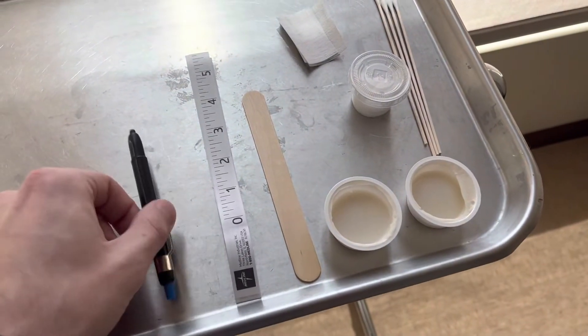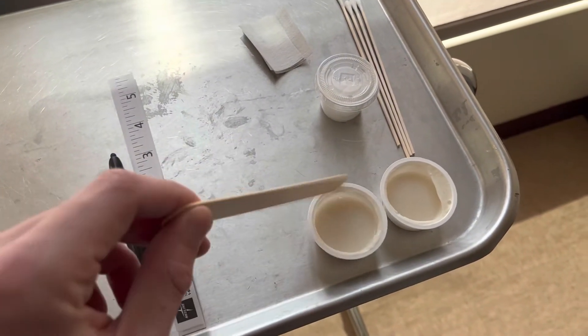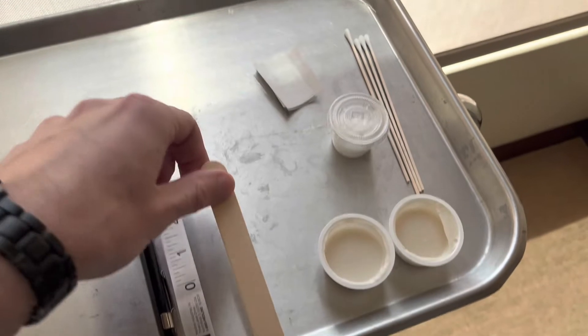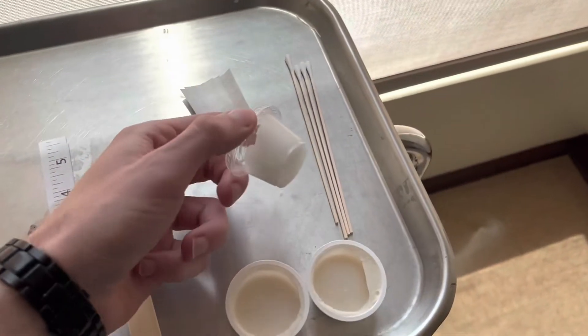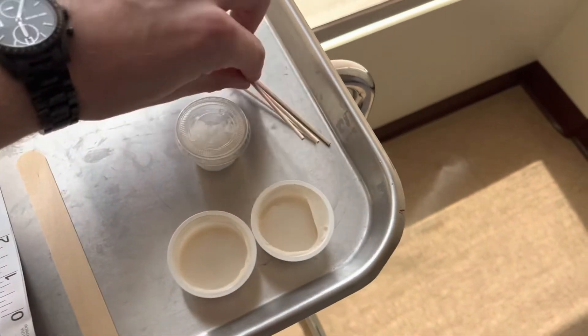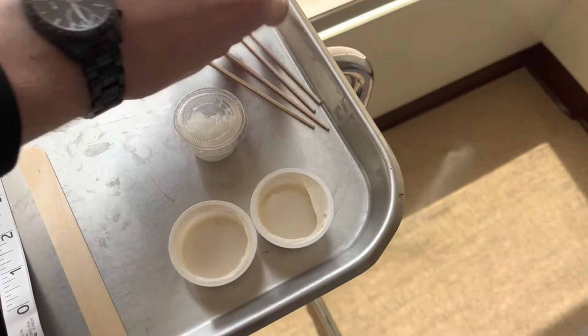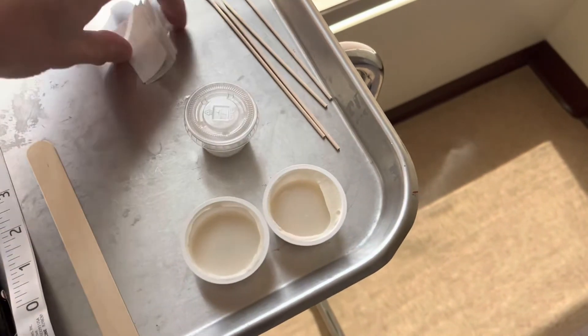I recorded this during my lunch break since it was not very busy today. First you've got your pen and measuring tape so you can measure the head. You've got a popsicle stick to scoop the paste out, and I like to put it on my glove for easy access. We also have some exfoliating soap and four q-tips — I use two at a time, but I keep backups in case one breaks or falls on the floor.